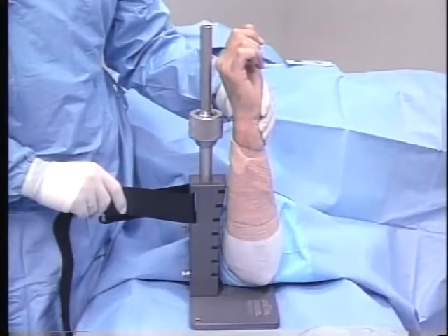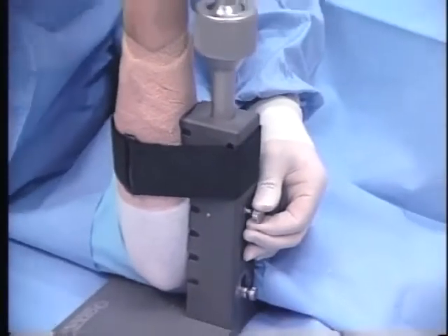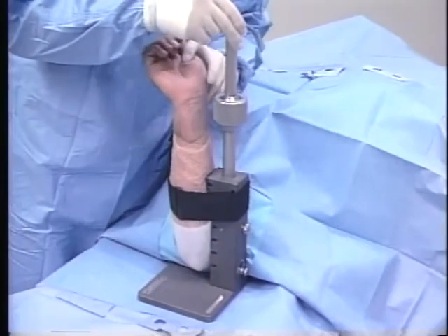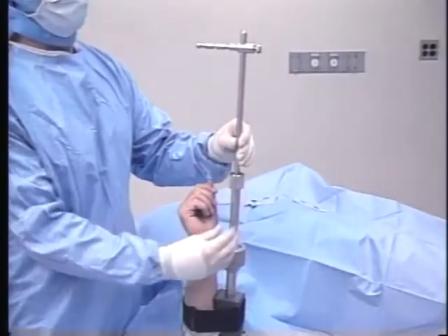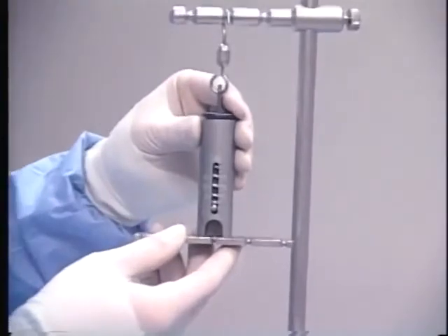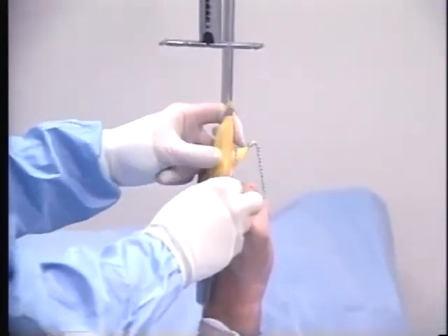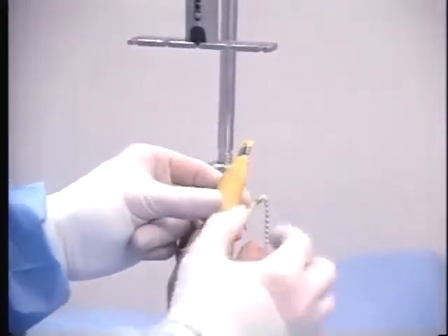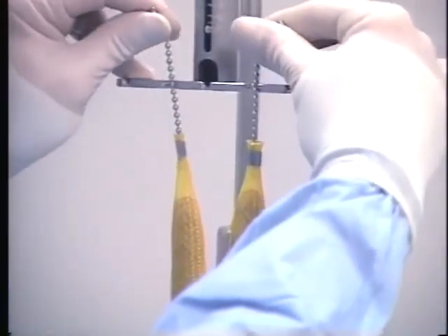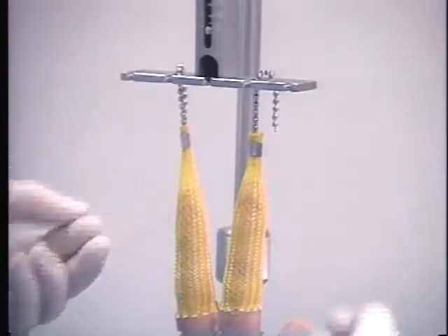Alternatively, attachment of the dorsal aspect of the forearm to the primary support will accommodate procedures requiring a volar approach. Through the use of the lower macro adjustment, the ball joint is positioned immediately opposite the patient's palm. The traction scale is then added to the most appropriate scale mount indent. Next, the digitraps are attached. The digitraps should extend beyond the proximal interphalangeal joints to prevent slippage. The distal aspect of the digitrap chain has a universal hook for use with other traction systems. When digitraps are used with a traction tower, the hooks are not needed and can be removed.